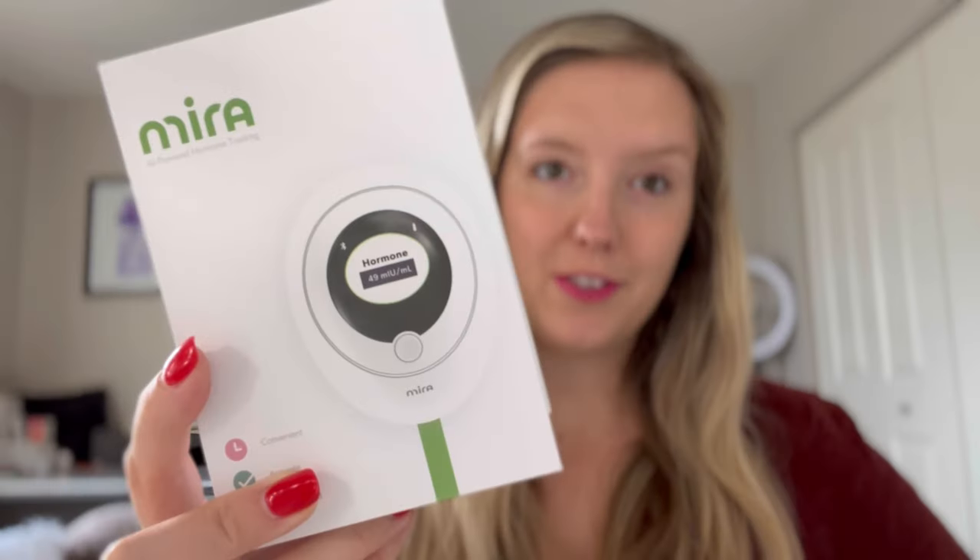So what makes Mira Fertility different? Well, they track both your estrogen levels and your luteinizing hormones, or LH levels, which stimulate ovulation — which is necessary for conception.